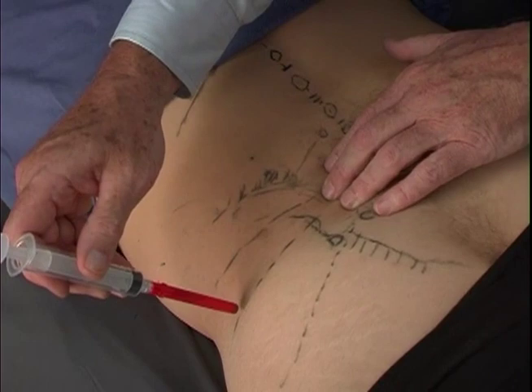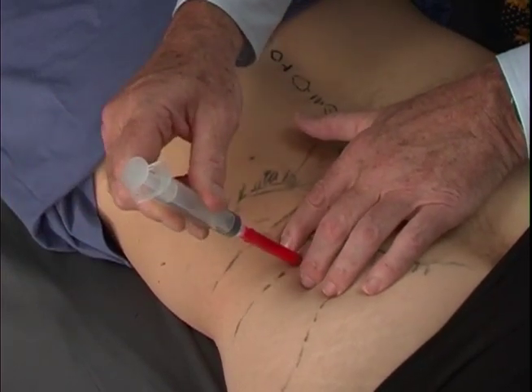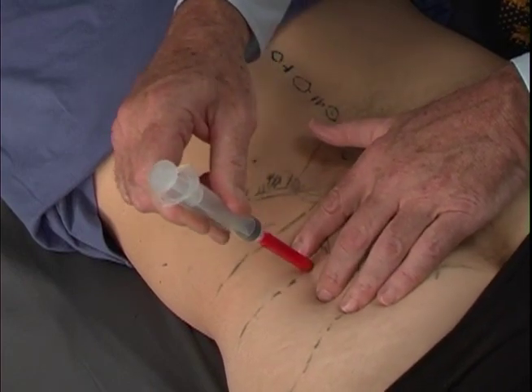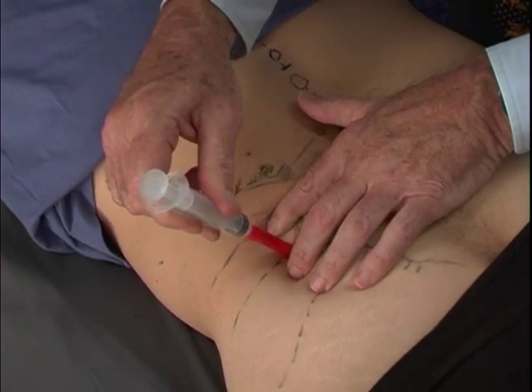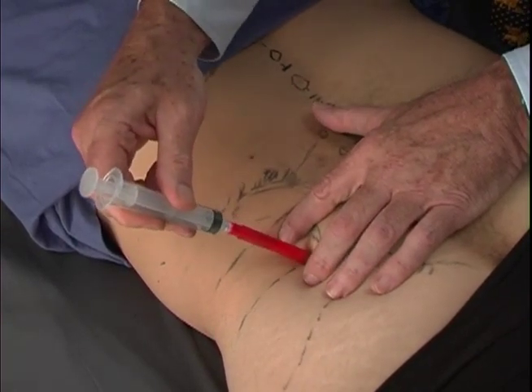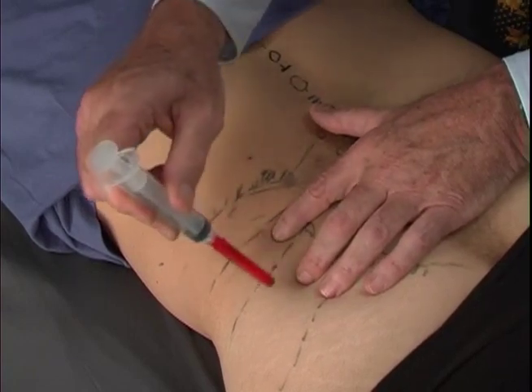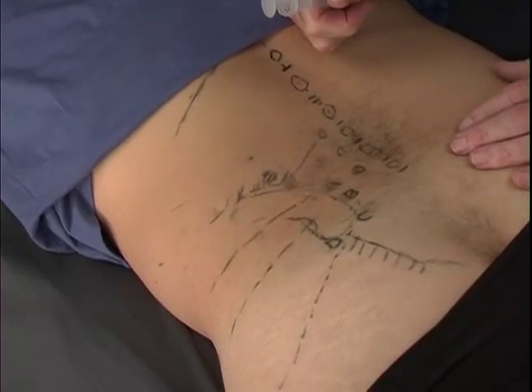Again, I usually do these injections with 1 injection coming out to the skin line, skin sliding down, doing another injection, coming out to the skin surface, skin sliding up and doing another injection, or by injecting and reorienting my needle just a bit in 3 or 4 different directions to pepper that area thoroughly along the gluteus attachments.